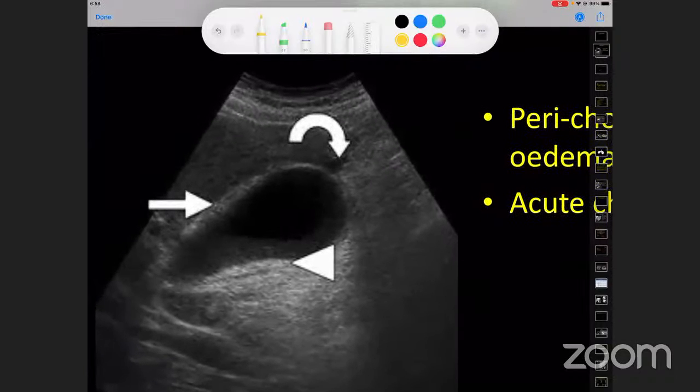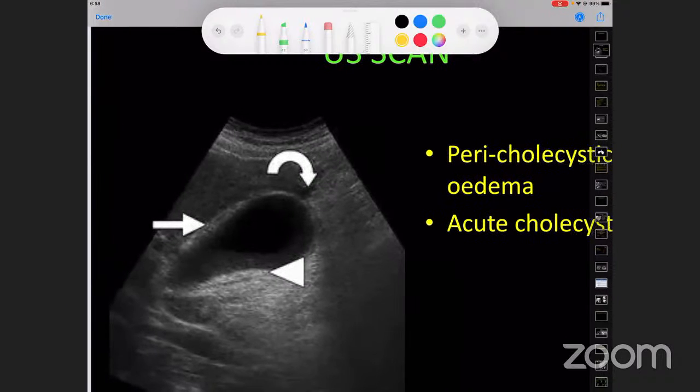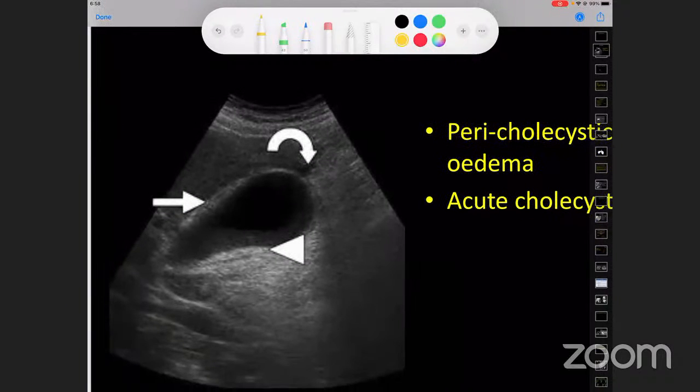Okay, just a second to interrupt. Can you please tell me those criteria? Yes, Dr. Bakshi, please. Avik, 4 millimeters or centimeters? The 4 centimeter is the transverse diameter of the gallbladder. Oh, transverse. Okay, right. So let me have these criteria clear. If this is A, the transverse diameter should be greater than 4 centimeters. Number 2, what about the thickness of the wall? It should be more than 3 millimeter. Okay, so B should be greater than 3 millimeter. Any more criteria?